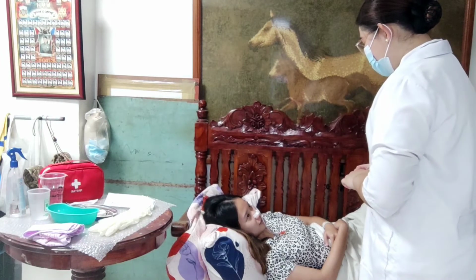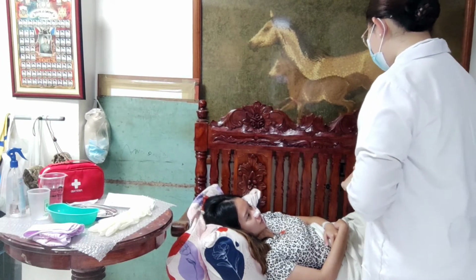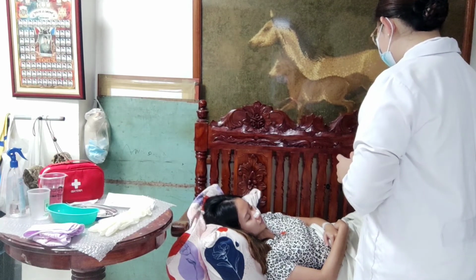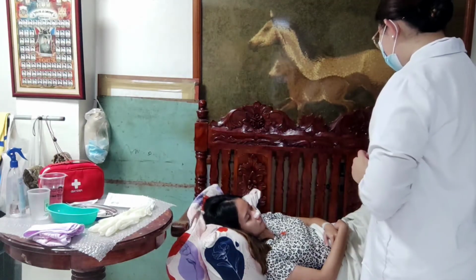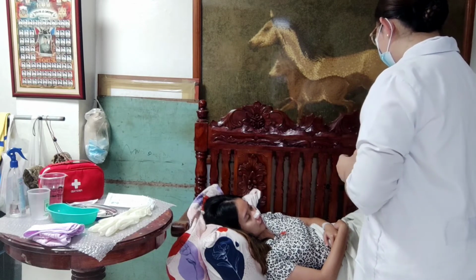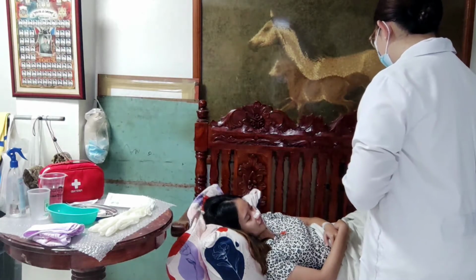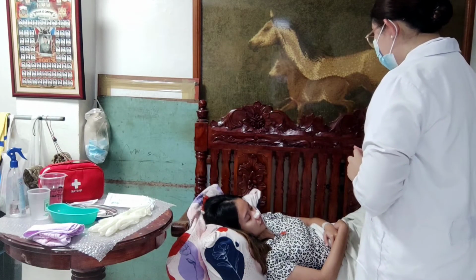Hermione Caventa. Birth date? August 22, 2001. Okay, Ma'am Caventa, today I will be proceeding to feed you through the NGT that is placed inside you, and you can participate while I'm doing the procedure. All you have to do is to tell me if you feel any discomfort, and if you have no discomfort, then you will feel a feeling of fullness. May I start now, Ma'am Caventa?